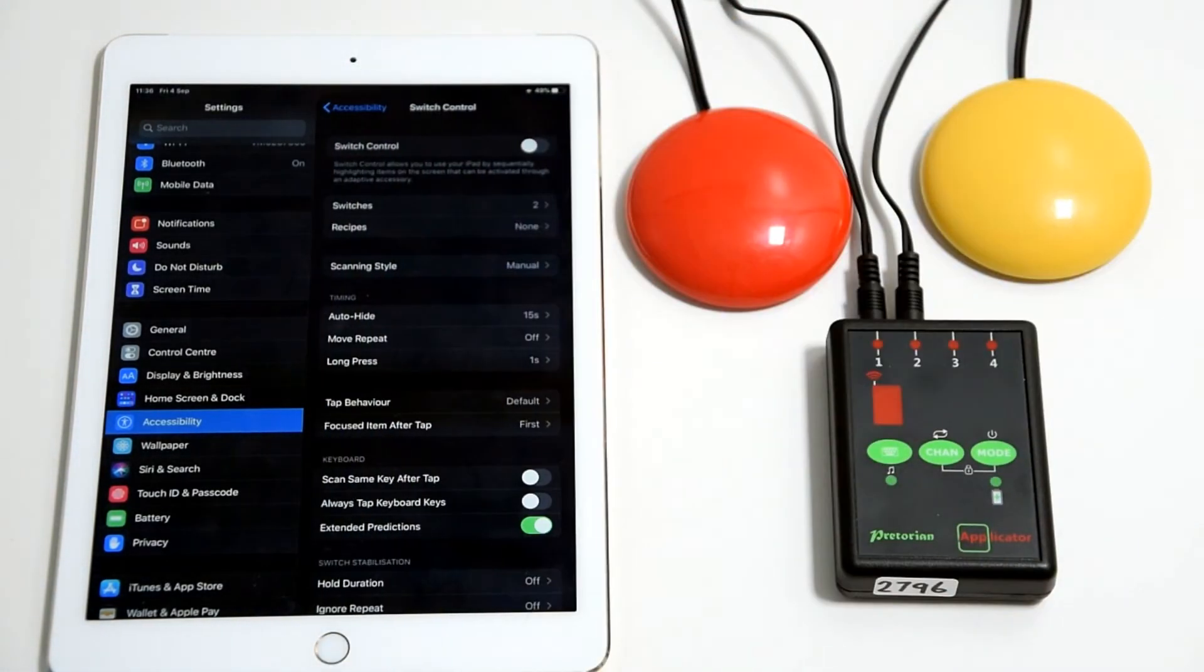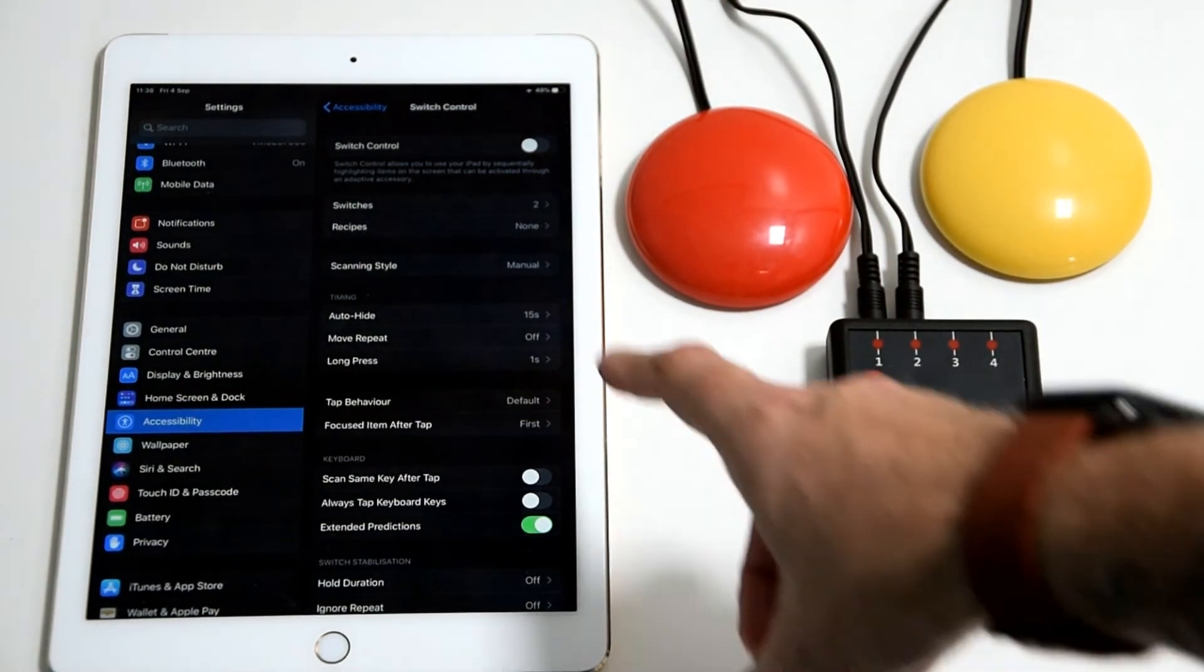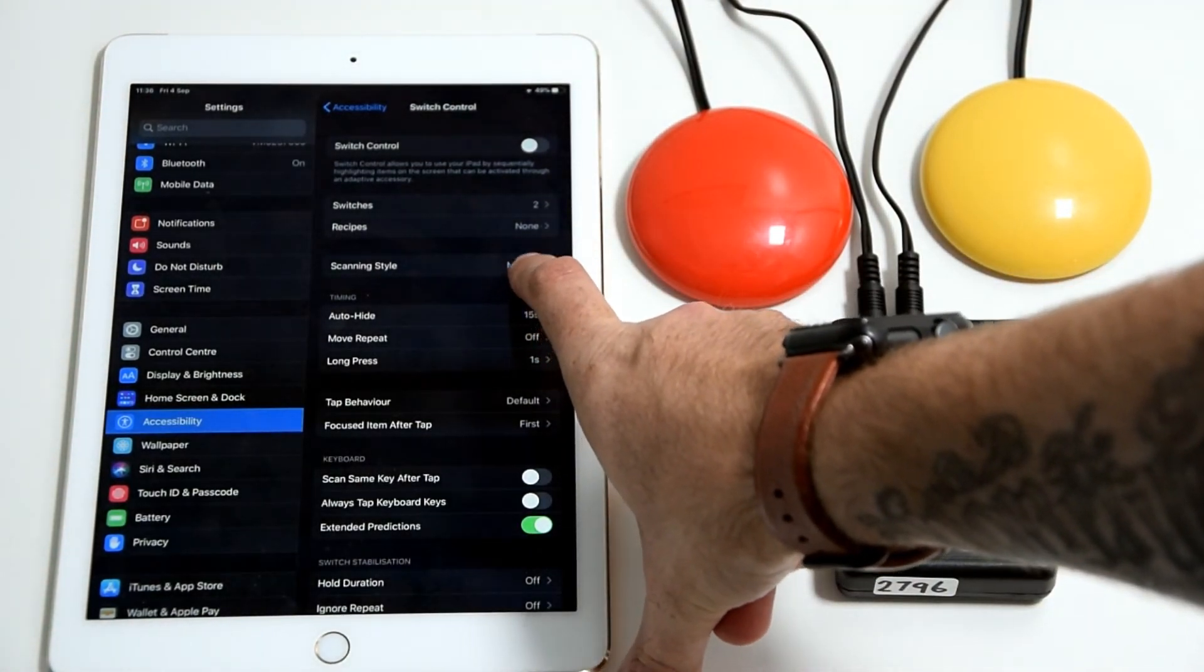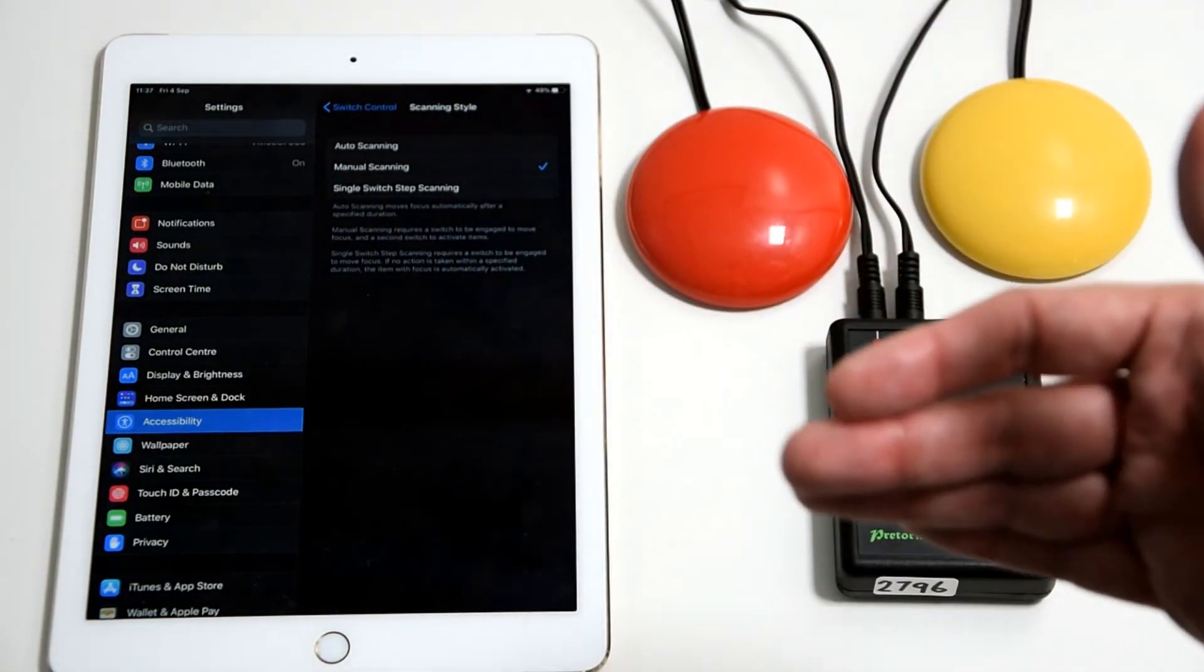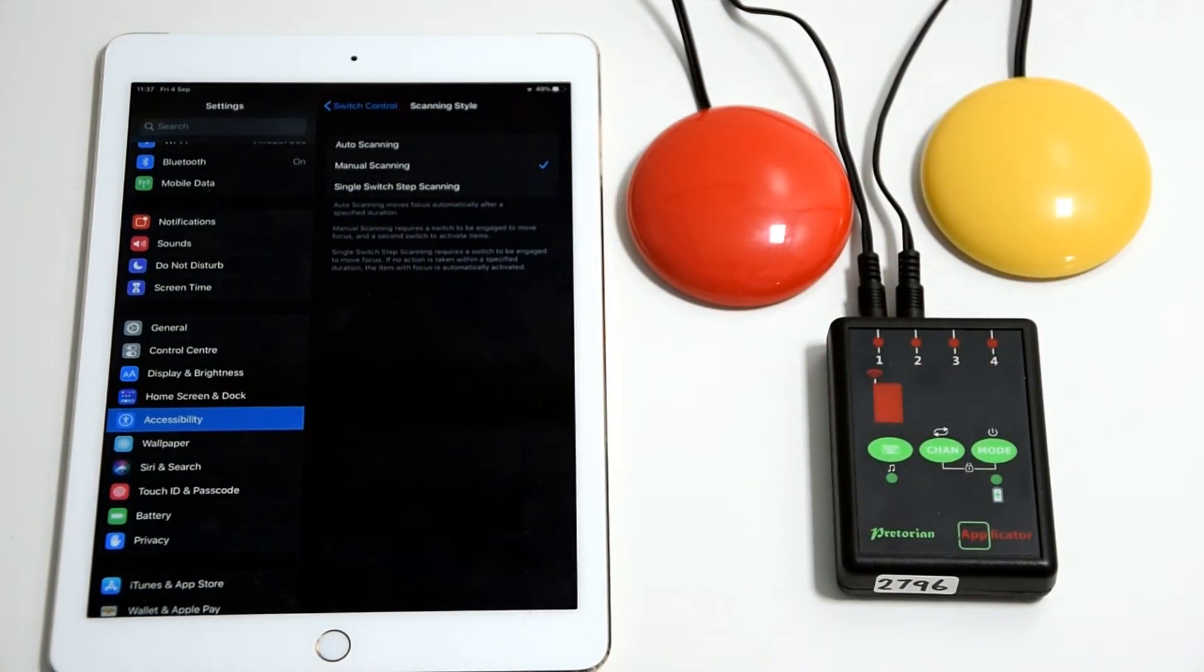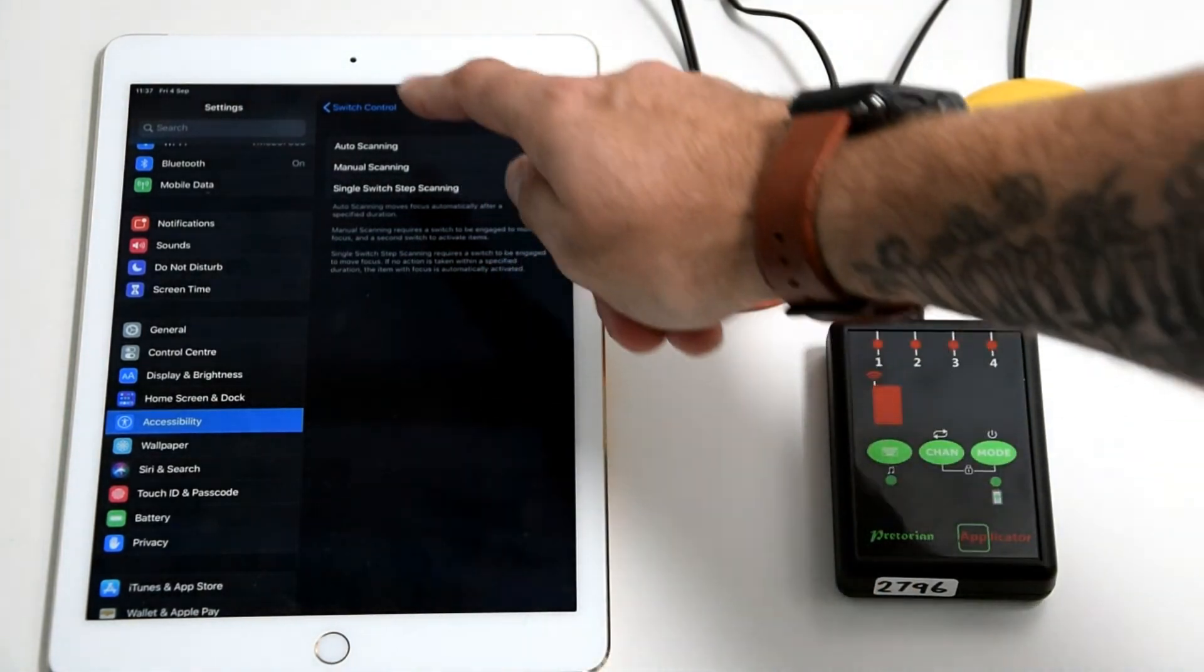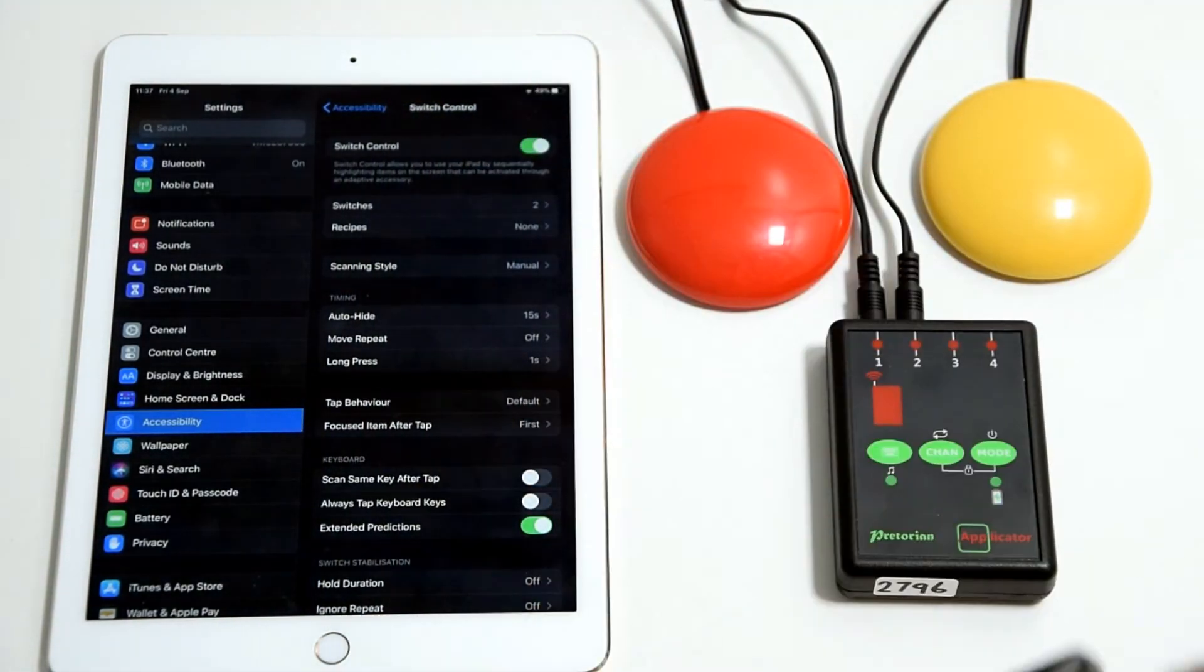That's all set up. Now you back out to this menu here. You just need to make sure that this section here, scanning style, is on manual. If I just click into that quickly, you've got three different options there and I'm going to go through those in different videos, but for this just make sure manual scanning is on, and then you can hit switch control.